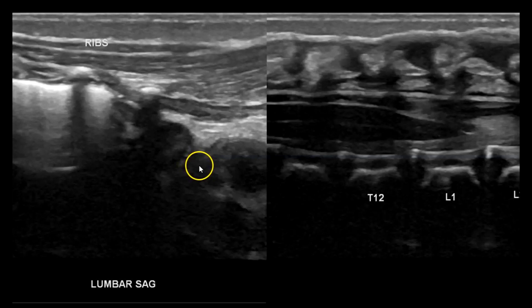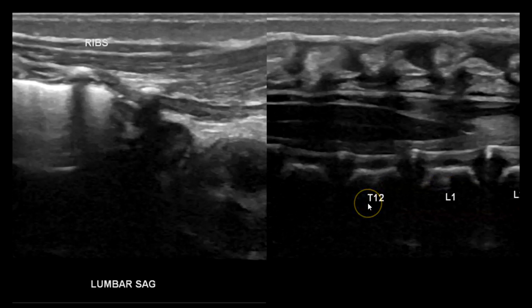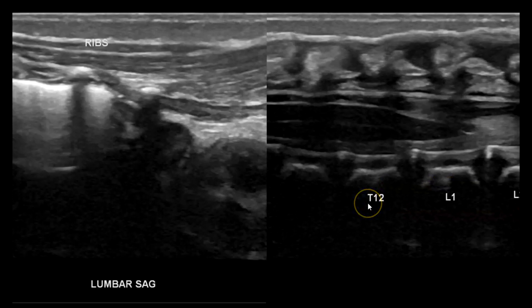Lastly, I like to count from the ribs — count to the last rib, which is T12, and then angle to midline to see the conus medullaris, to make sure it ends at L1 — the same result as counting up from the sacrum. Just to double-check that the conus medullaris is ending at the right spot. So: T12, L1, L2. There's a labeling artifact from switching between dual screen and solid screen, but confirmed T12, L1, L2.